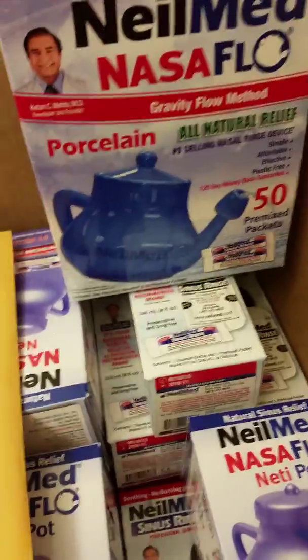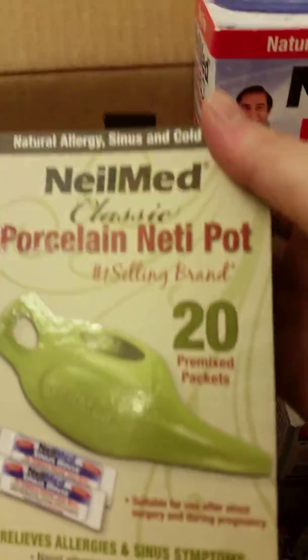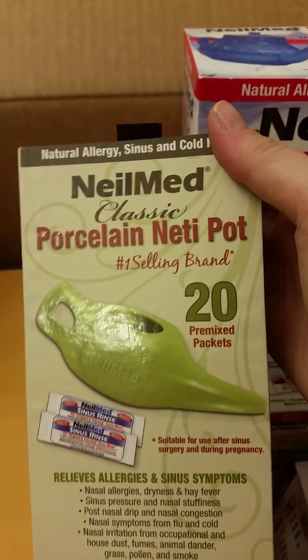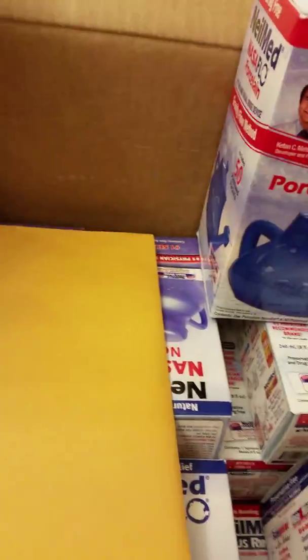It also comes with 50 — well, these are supposed to be giveaways. The porcelain neti pot comes with 20 packets. It's really nice. I'll open this if I have time at the end and show you what it looks like inside.